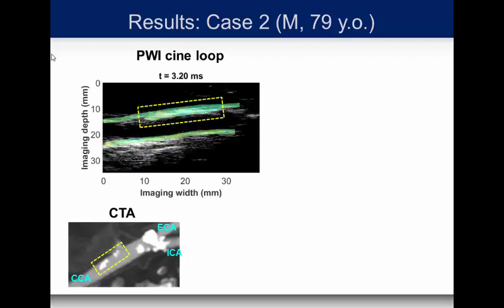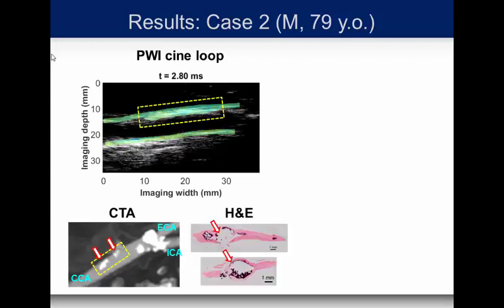For this particular patient, we were able to obtain the specimen during surgery and do some staining to confirm the calcifications. So we stain these 2 segments separately. Then we can see the 2 calcified regions on the H&E stain.